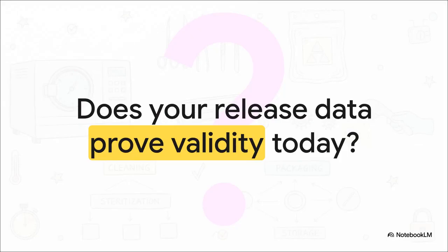If an auditor walked into your facility today, like right now, does your routine release data actually prove your process is still valid? Are you relying on weak sterility tests, or do you have rock-solid, calibrated process evidence? Do you assess changes proportionally, and are your contract sterilizers tightly bound by strict technical agreements?